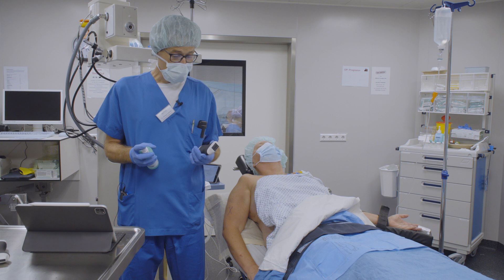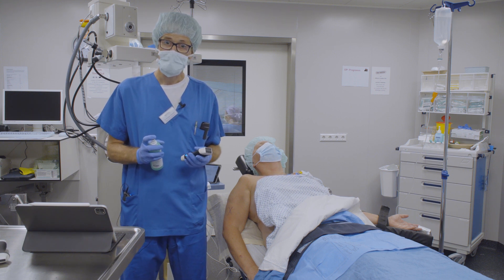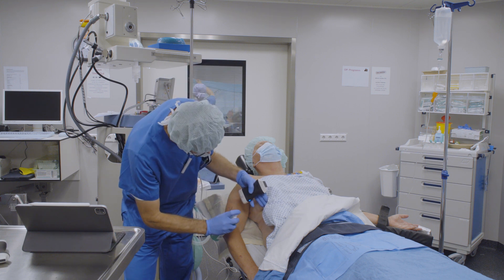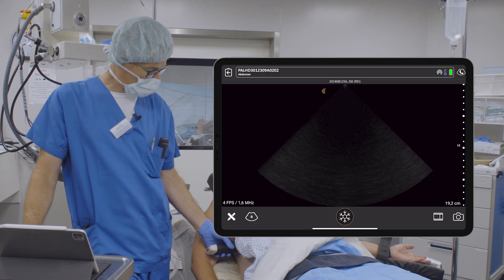In order to demonstrate this, I will quickly assess the diaphragmatic function before the interscalene block. I do this in an abdomen preset. Jetzt wird's mal kurz ein bisschen kalt. I put the probe on. The marker is directed towards the mattress.